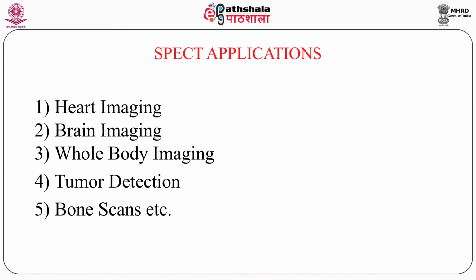Now comes tumor detection. As I referred, nowadays tumor detection is a very, very important thing. Suppose in oncology, the patient has been diagnosed with a cancer, a tumor, at a very early stage, which is possible by SPECT only, because MRI could not find it. MRI found that there is a problem, but with SPECT you can see the function, you can find the depth and location, and by using SPECT-CT you can get a really good quality image. Then when the tumor is detected and either surgery is done, or chemotherapy or radiation is given, you really want to see how the progression takes place, whether the tumor has been treated, or whether further examination or treatment is required. So SPECT plays a very, very important role.